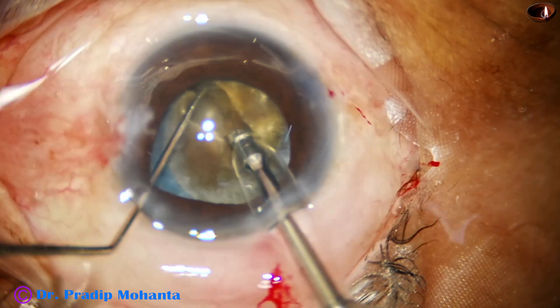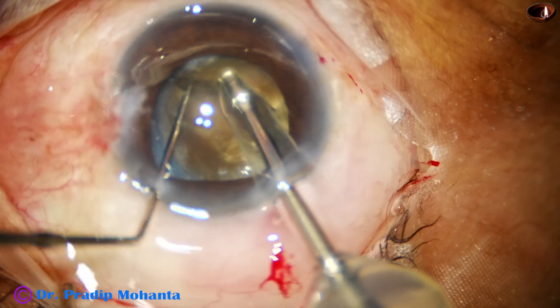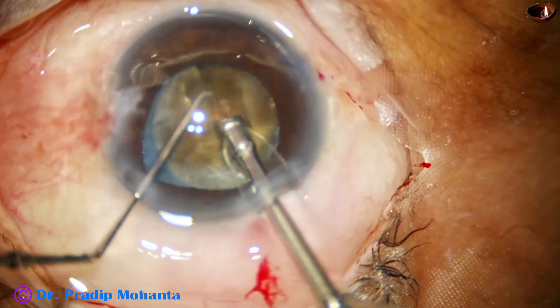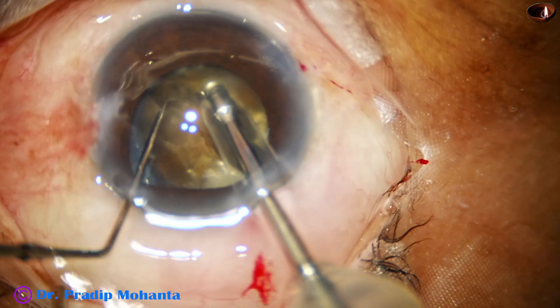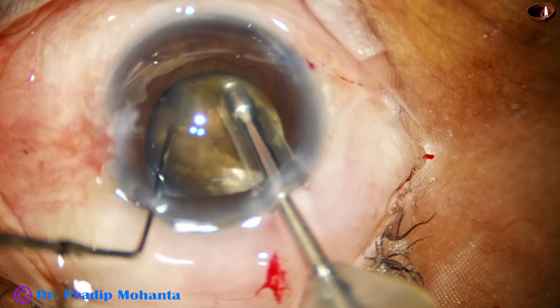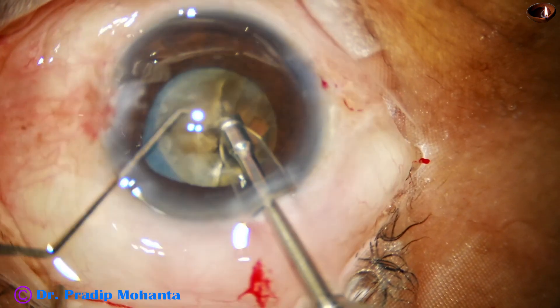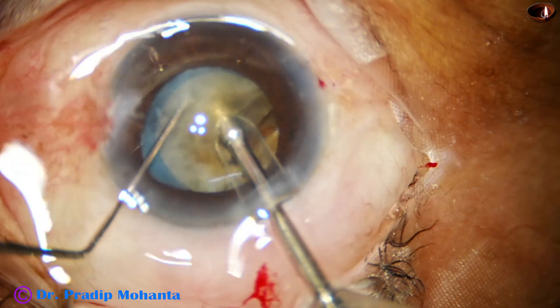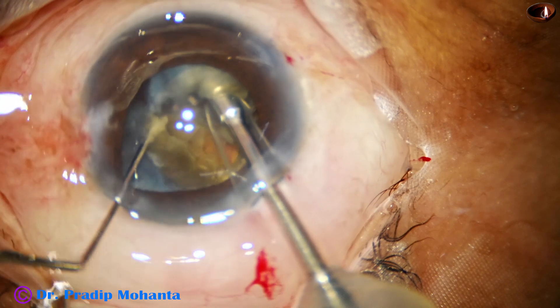I rotate it 180 degrees and sculpt the central part. I hold one hemi-nucleus and find that I cannot separate the two hemi-nuclei. I hold it at the center and try to separate them, but I fail. So in this case, I did not get two free hemi-nuclei.